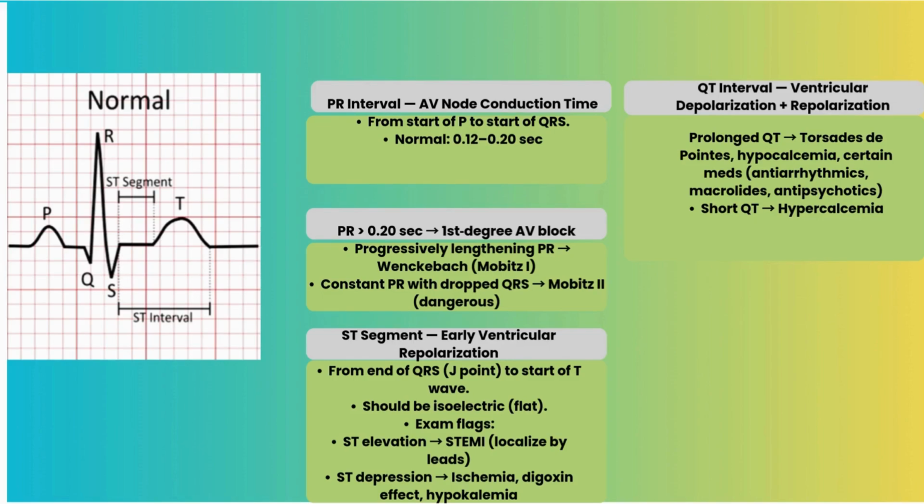However, prolonged PR interval is no bueno. It's signs of heart block.